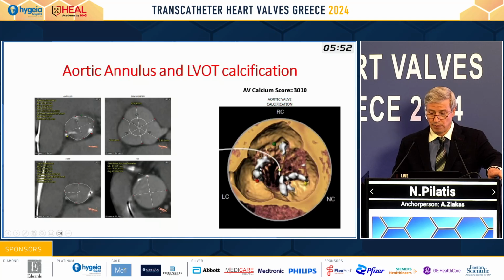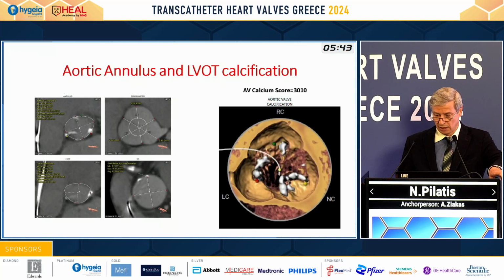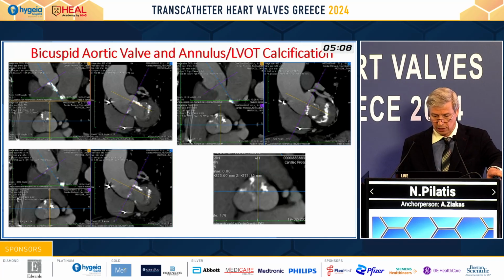So the question is, when you have a bicuspid valve, should this patient go for a TAVI procedure? Are there any very high risk characteristics for a TAVI procedure, which is a severe calcification of the aortic valve, of the raphe, and the intercommissural space? So the answer in this patient is no, there is no severe calcification. So the TAVI procedure should be at non-very high risk for aortic root rupture or malposition of the TAVI valve because of underexpansion due to severe calcification. So we aim to proceed with the TAVI procedure.